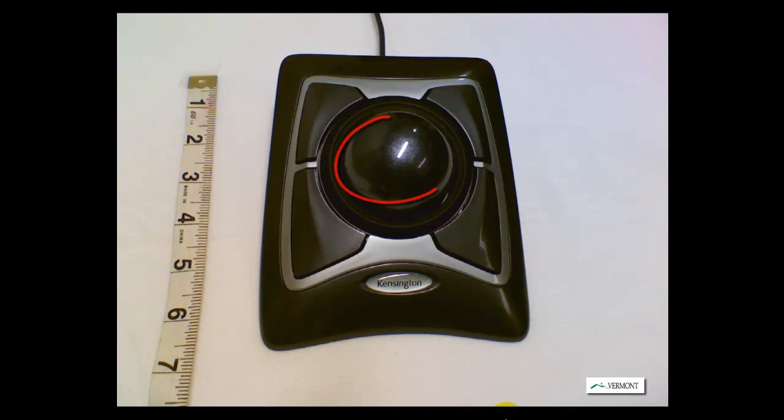The size of this particular ball is slightly smaller than a cue ball. To move this ball, the person can use the palm of their hand, the heel of their hand, the back of their hand, or maybe even the forearm, which will cause the arrow or cursor to move around the screen.